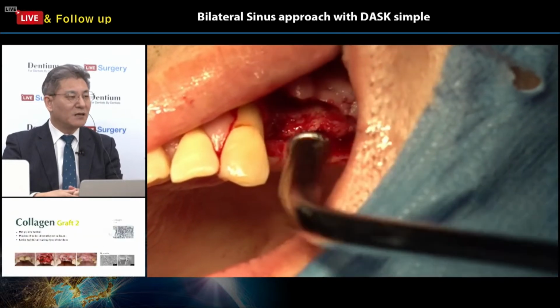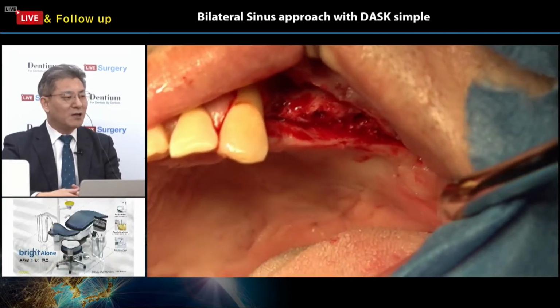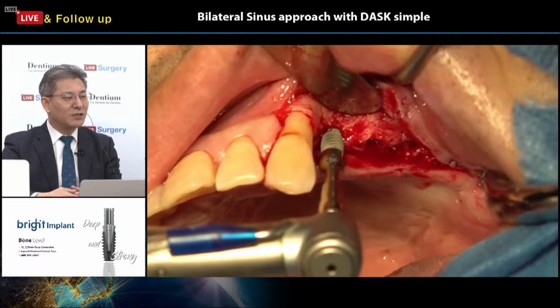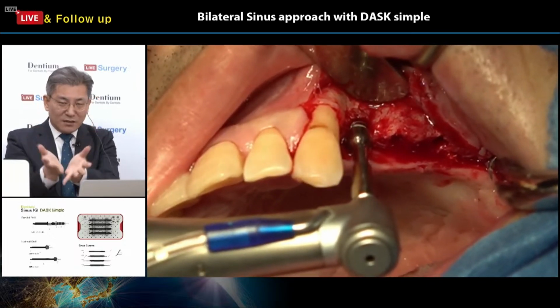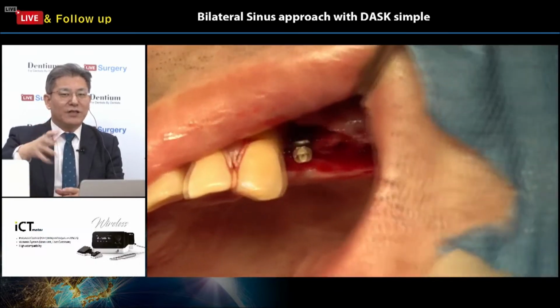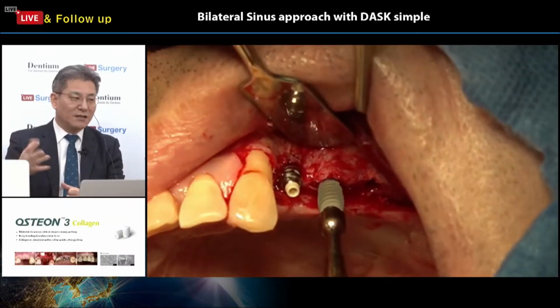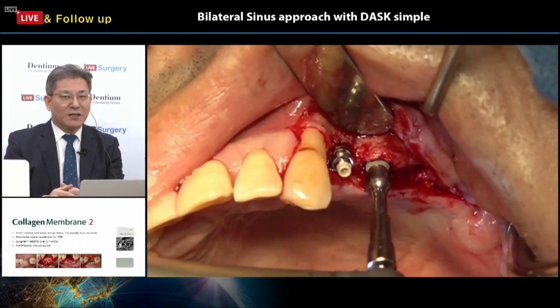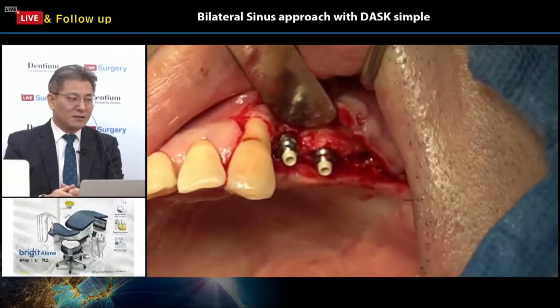Yeah, he is planning for 3.5 diameter, 9 millimeter tissue level. Now he is doing the installation. With these tissue level fixtures, the apex is sharply tapered, so it is easy to seat. However, during the condensation of the bone, we can get this implant fixture going more and more, with stability getting better and better, and good stability.